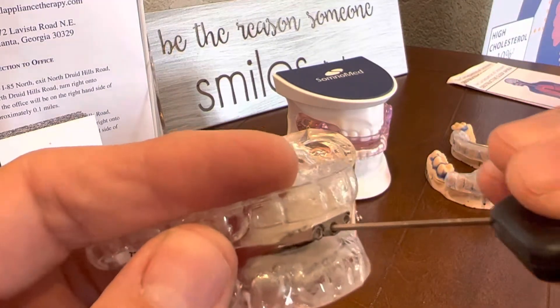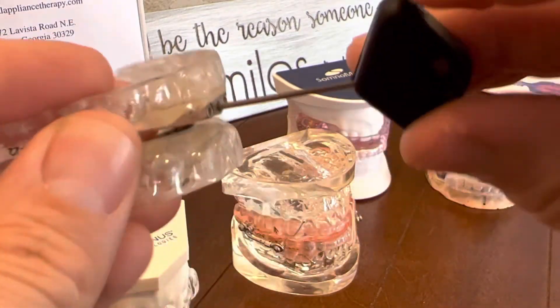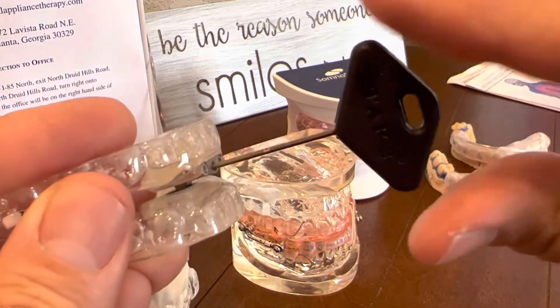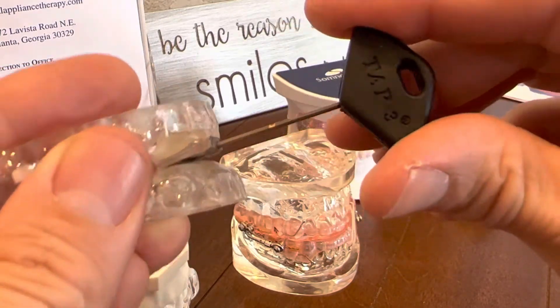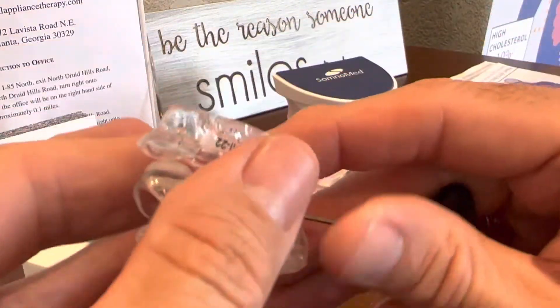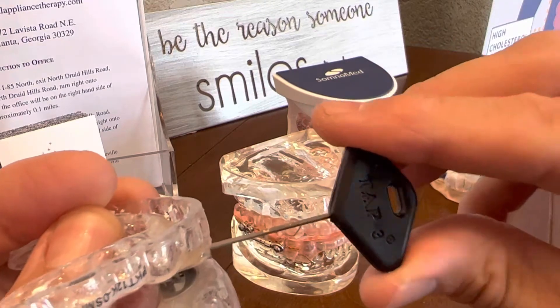Once you find that you get it into that screw and you engage it, you make sure that it's locked all the way. And you're going to turn it clockwise — one spin, two spin, three spin — as far as we tell you to spin it. So if I tell you to spin it two times, you're going to spin it one time, two times.